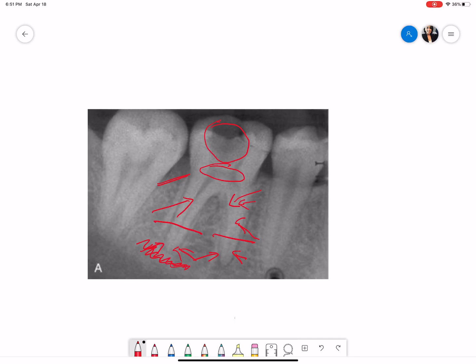Now coming to the normal radiographic anatomical landmarks, you see this part shows some hazy radiolucent area. This might be the submandibular gland fossa, and also this area shows some amount of radiopacity which is overlapping the apex of tooth number 31 and overlapping the sclerotic bone formation with respect to the distal root of tooth number 30.